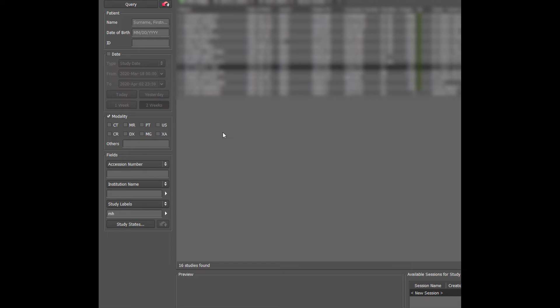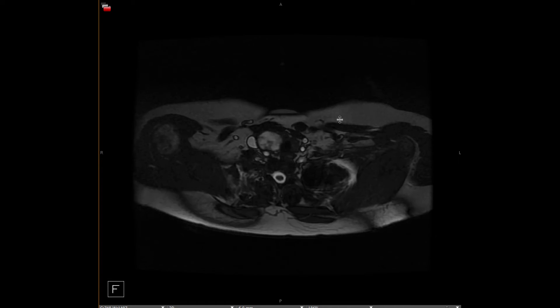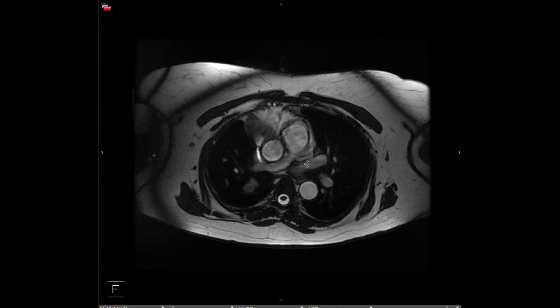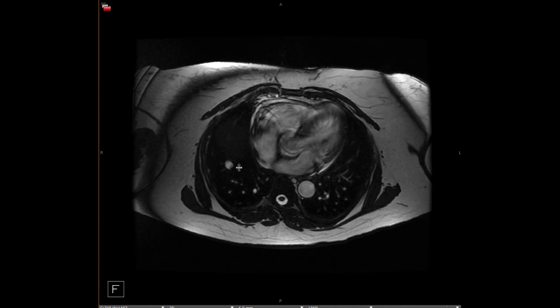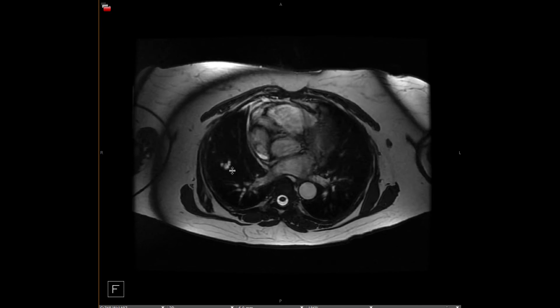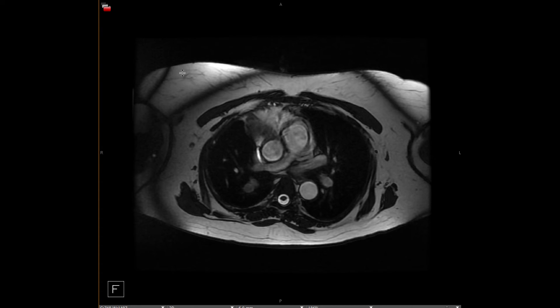Finally, scimitar syndrome. It more properly fits into anomalous pulmonary venous return, but it's included here because the lung itself is also abnormal. On MRI, you can see the right lung is a little bit small, with an abnormal vessel here that drains to the IVC — this is anomalous pulmonary venous return. The pulmonary artery circulation is normal in this case.